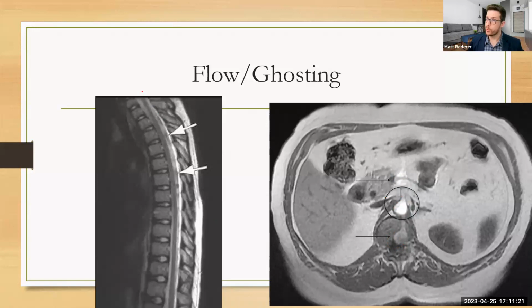Here we have cerebrospinal fluid coming down the spinal canal, and as we acquire information, we saturate out some of that cerebrospinal fluid, creating these dark voids in our image here. It looks like possible little lesions. And so rads hate that. It confuses them, but it's flow artifact. And we can use different tricks up our sleeve, something called gradient moment nulling or saturation bands, things you might have read about. But those are typically our tricks to get rid of this type of artifact.